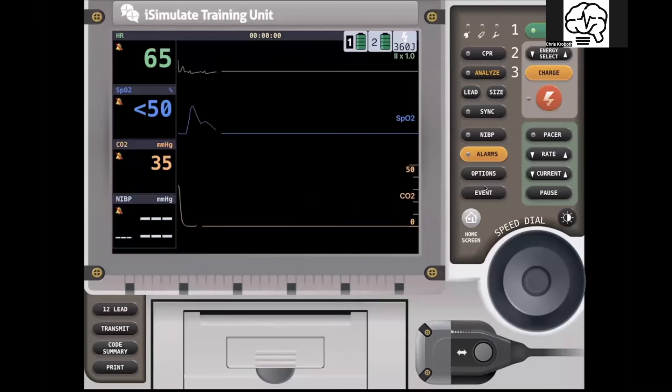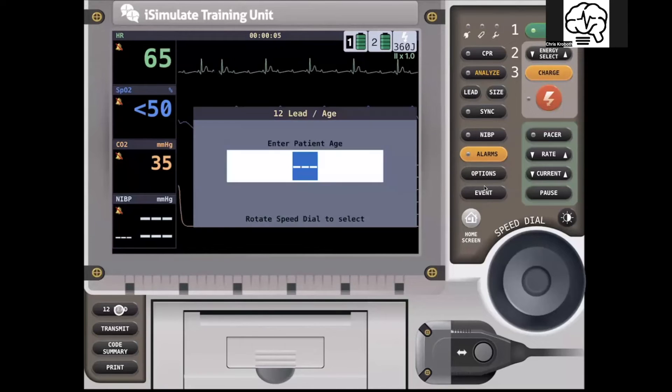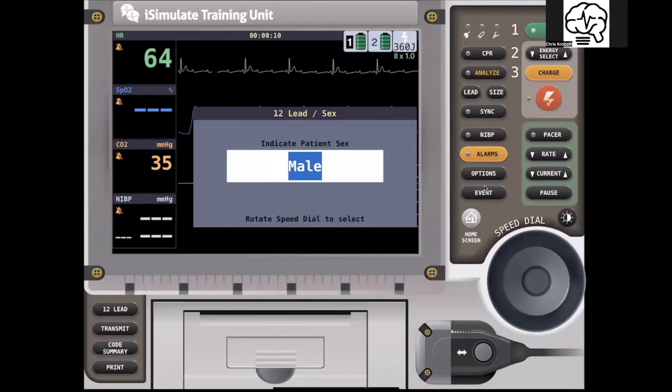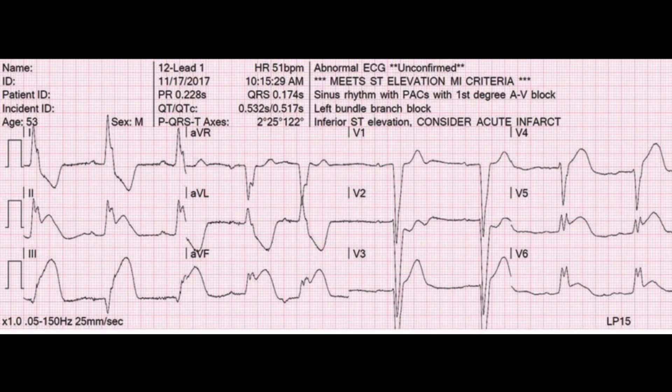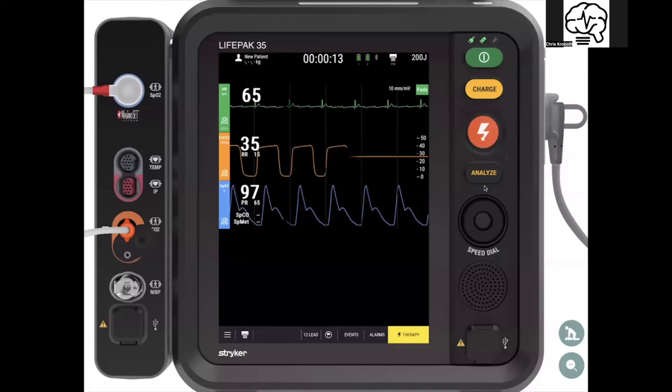What would that look like on the LifePack 15? You'd hit the 12-lead button, it would ask you age, you'd click the dial in for sex, and it would give you that printout. Both devices will start to print out another EKG if the ST segment elevation changes during transport, because an ST change has occurred while the patient is connected — that's why it's important to leave the patient connected to the monitor.